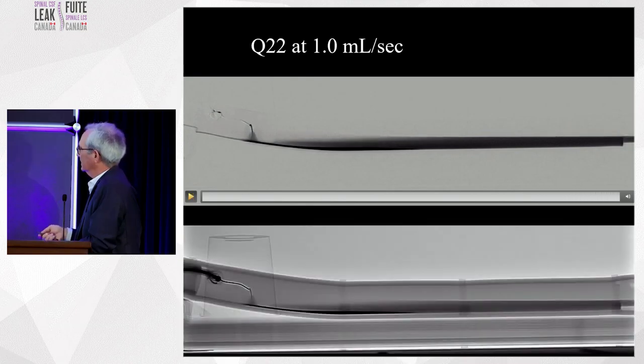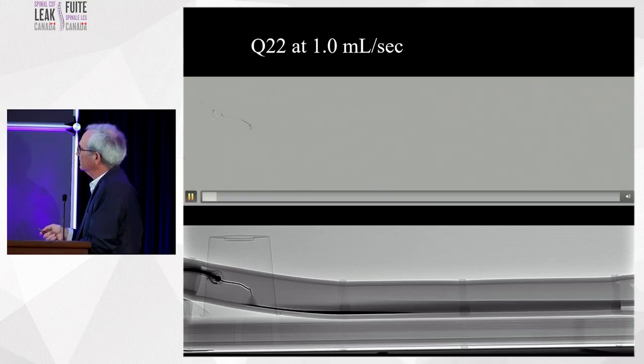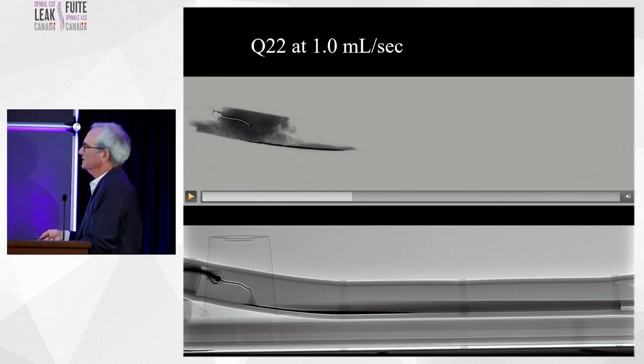If I go to the next slide, you can see this is the unsubtracted picture. This is all dilute contrast up here. This is the dense contrast layer, but what we want is this hyperdense layer down here. This is optimal. And if we play that, can you play that video on the top again? And just freeze it when you see the burst. Keep going. Yeah, that's the burst. Freeze it there. This is when the injection is actually at 1 cc per second.